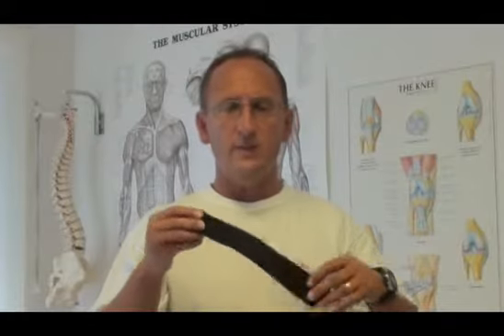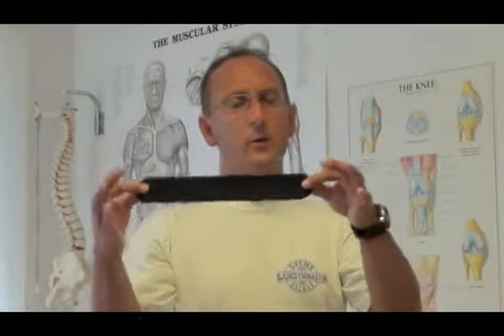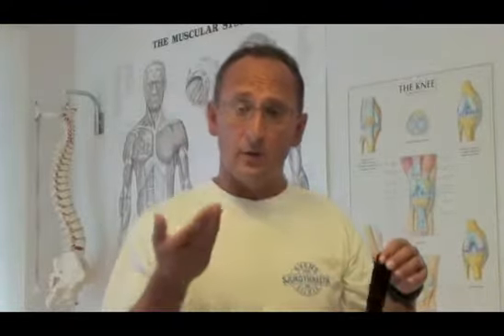So it always depends on which way, where do I start, where do I end? What do I want to do with the tape? Do I want the tape to help the muscle to work up, or do I want the muscle to release, to let the tension off? That's important to know. But now it's very important for you to listen, because we want the tape to help the muscle, and we want to put the tape on to release the pain we have in the elbow.